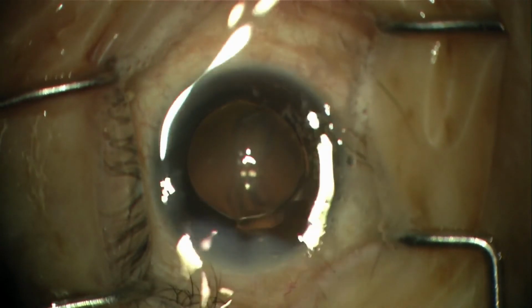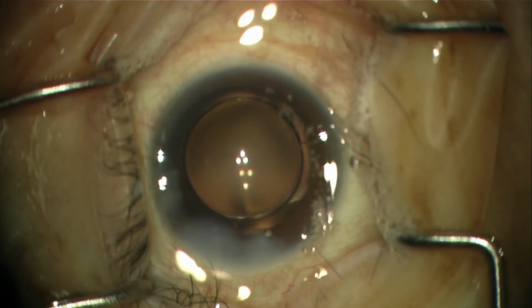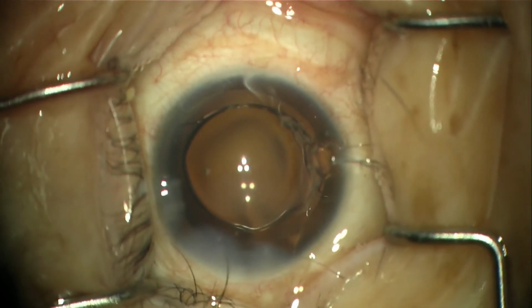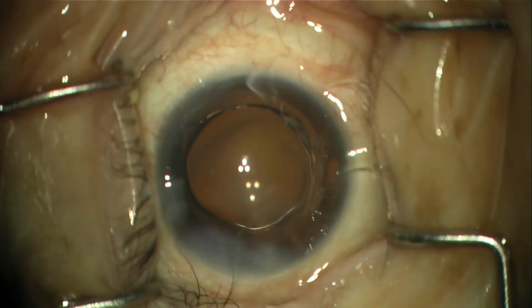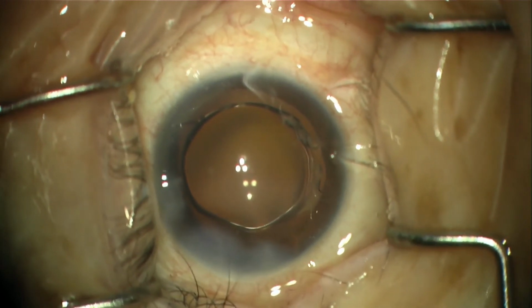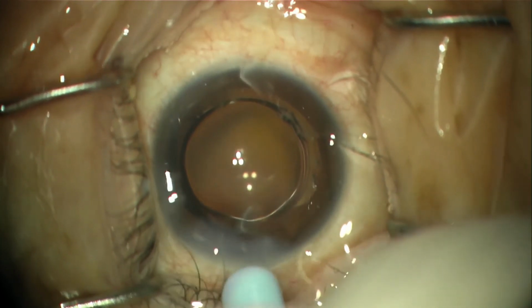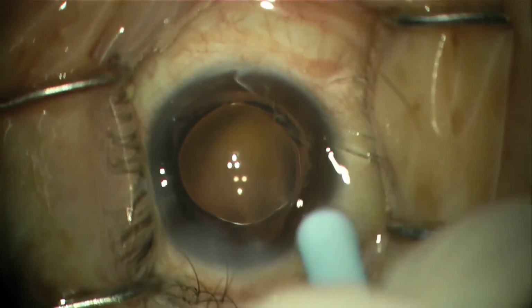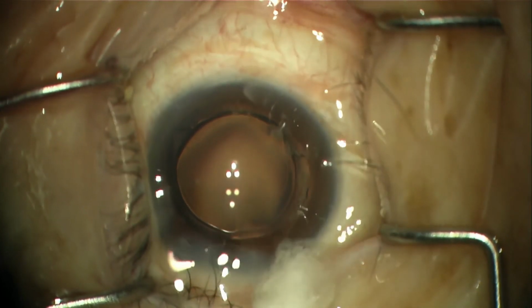We'll be clearing off the viscoelastic as part of the last part, but this shows you the complete, minimally edited standard cataract surgery procedure. Here we're just doing a little bit more cleanup, but I hope that this informational video has helped you understand a little bit more in terms of what is involved with cataract surgery. This is just the basis for many other variations of this cataract operation.